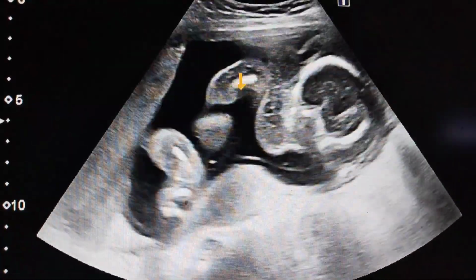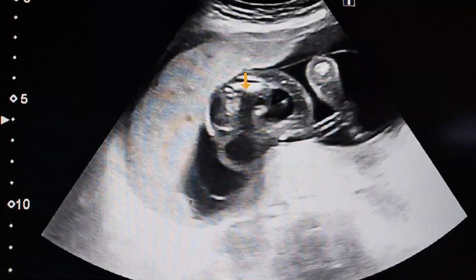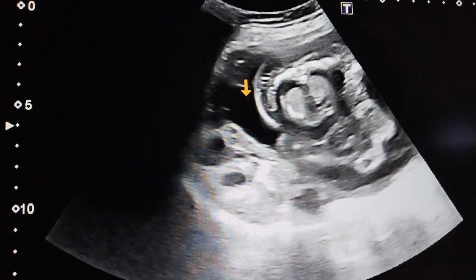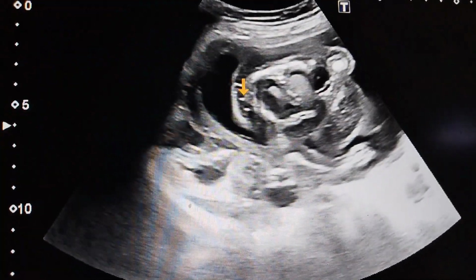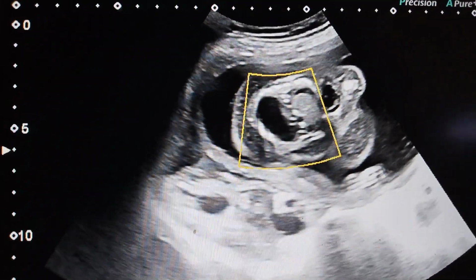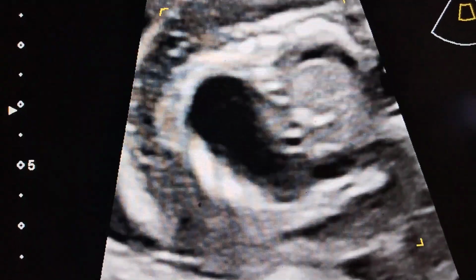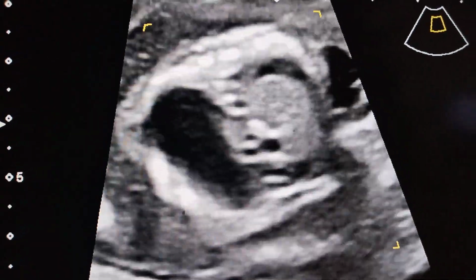Other is the fetal cardiac cause, which is common; the fetus may have cardiac failure due to cardiomyopathy, or due to arrhythmias, or due to some congenital cardiac defect. When this occurs, there is cardiac failure, and then when the cardiac failure occurs, there is venous congestion, then fluid leaks out of the vessels and then accumulates in the subcutaneous tissue and is the edema.